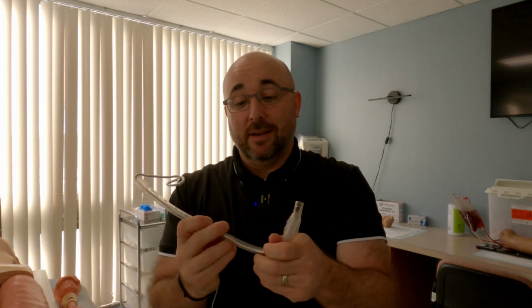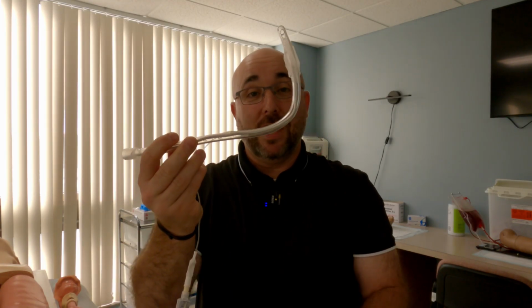The next thing I like to do is to ask the person that's intubating, do they like their tube bent a certain way? So some people have preferences, most people don't really care. But I've worked with some anesthesiologists before that like a specific bend. So this is one specific bend. I've heard this called a hockey stick before. So that is a straight 90-degree angle.